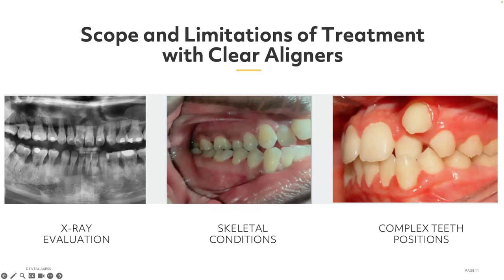That means we will need to make the treatment plan in 2 phases. First, we move the teeth and open the space for that canine, but we will need to use an external device like a button and elastic to bring that canine into the arch shape. And when we have it, the aligner can cover it and move it. So that's going to be phase 2.